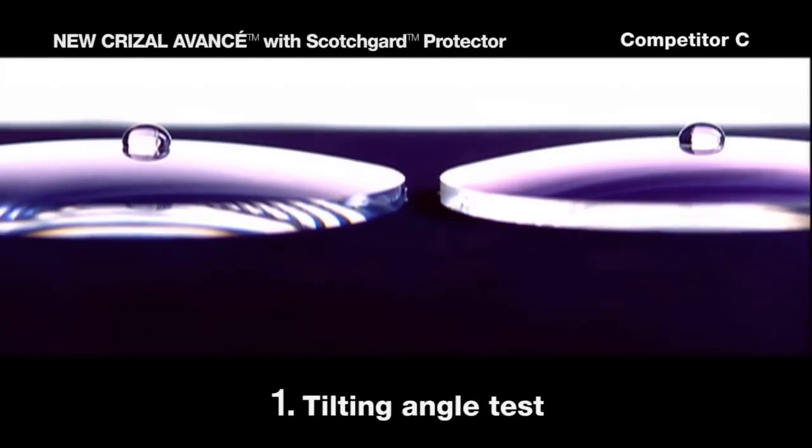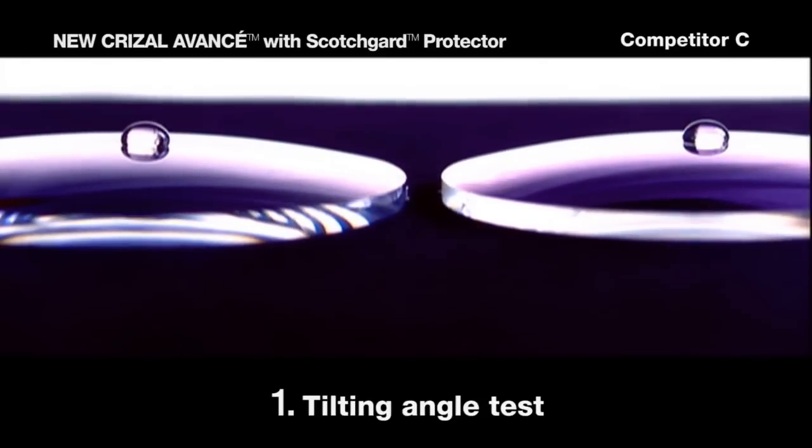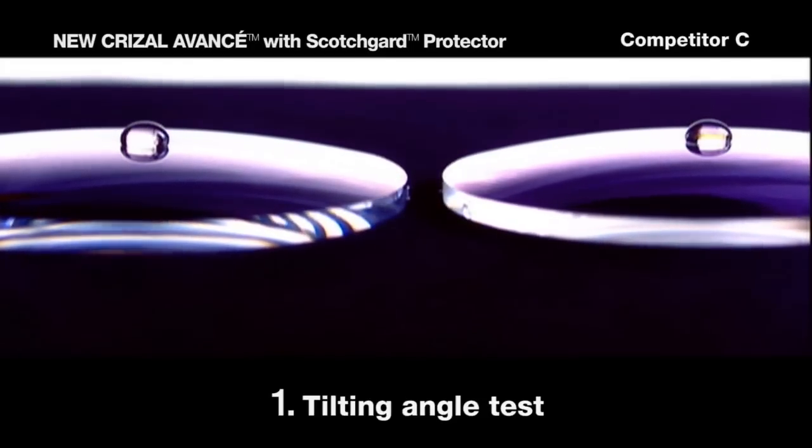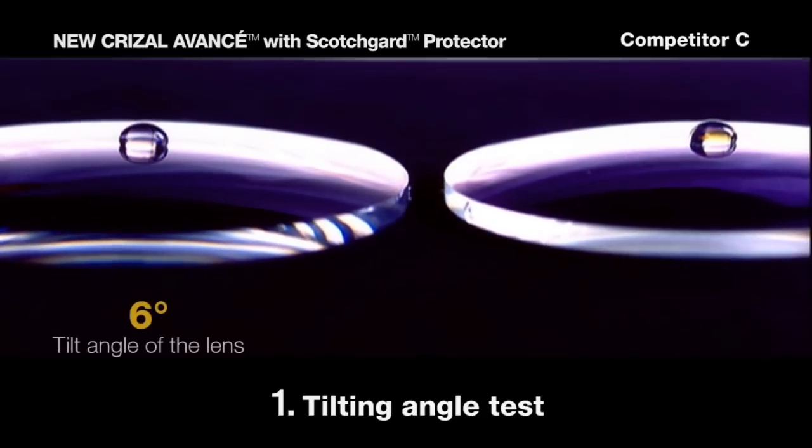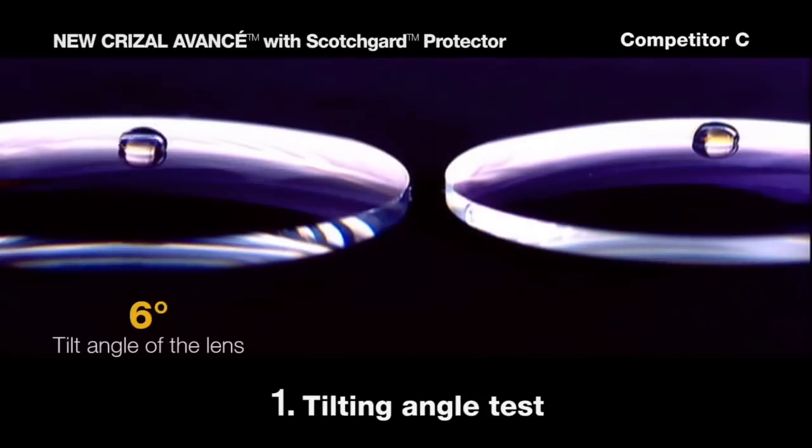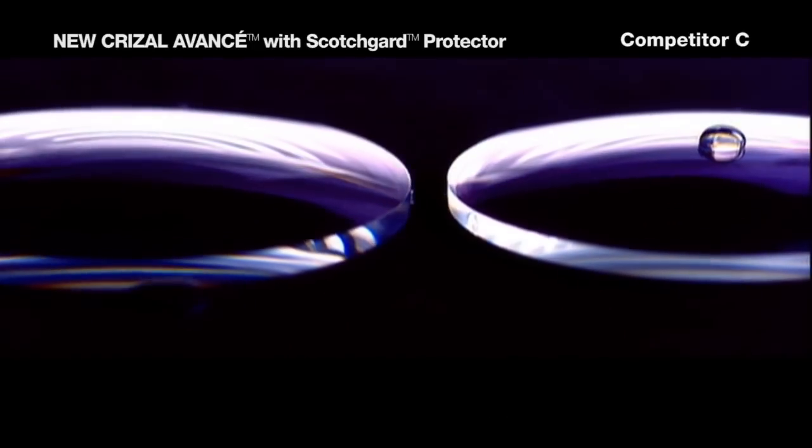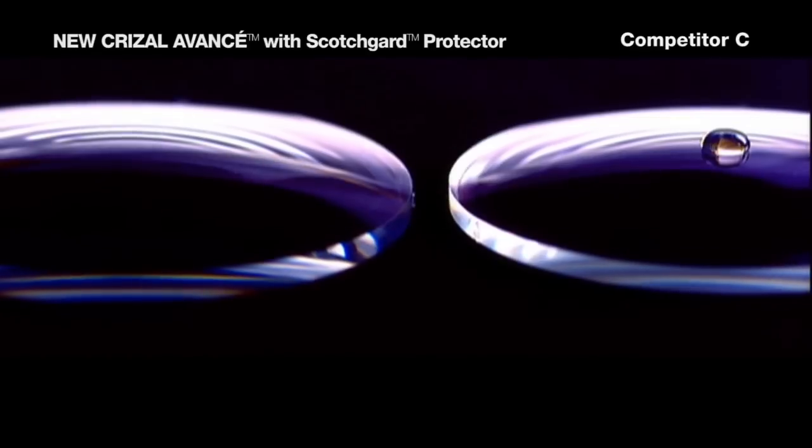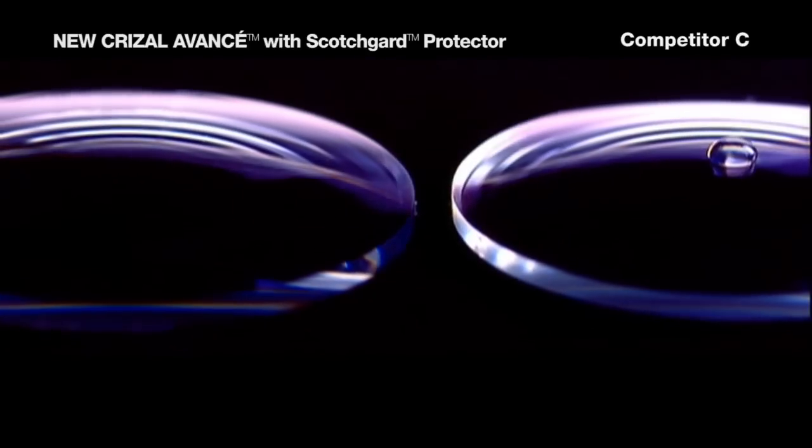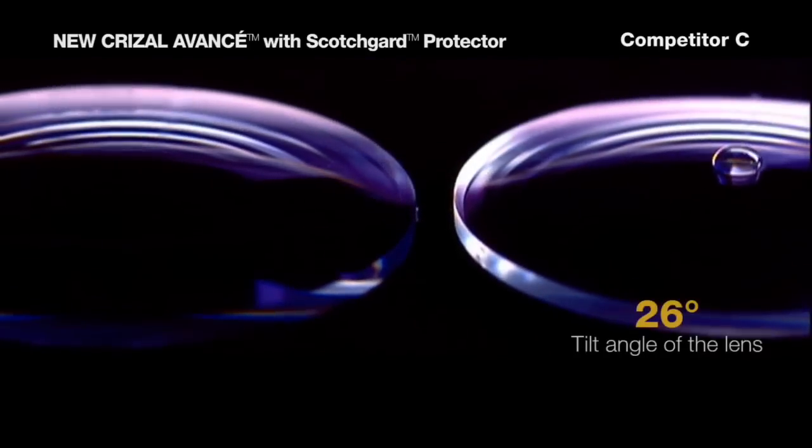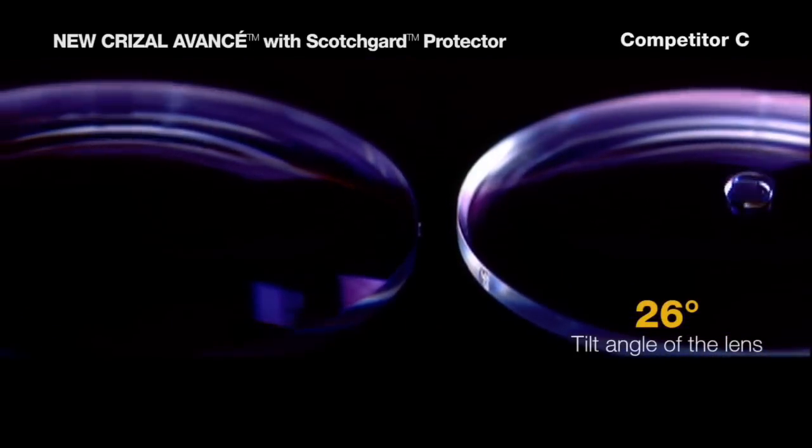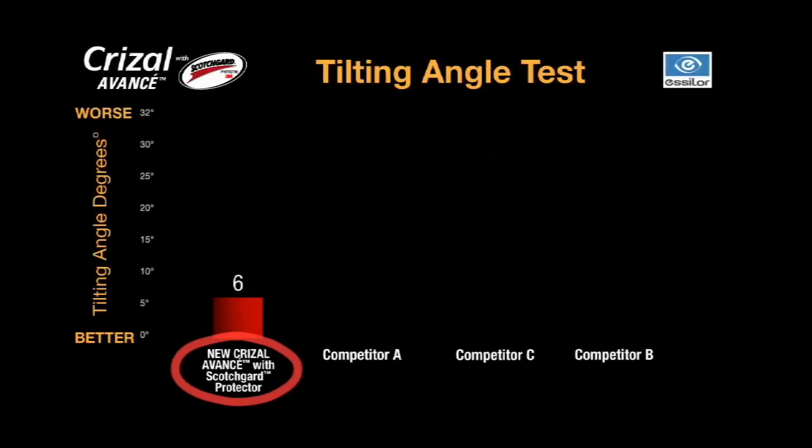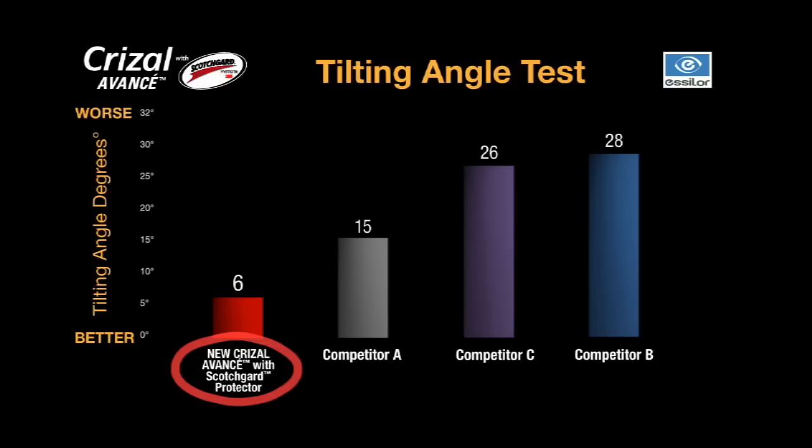To demonstrate the effectiveness of the HSD process, two lenses are tested side by side in the tilt angle test. With this test, the lower the tilting angle, the higher the smudge repellency. The low tilting angle of the Crizal Avance lenses with Scotchgard protector proves that the super hydrophobic top coat is the best on the market.